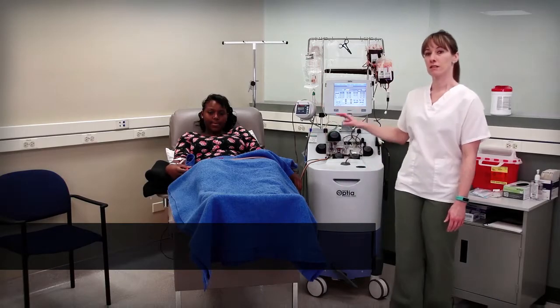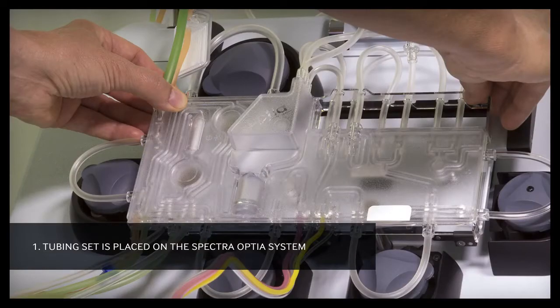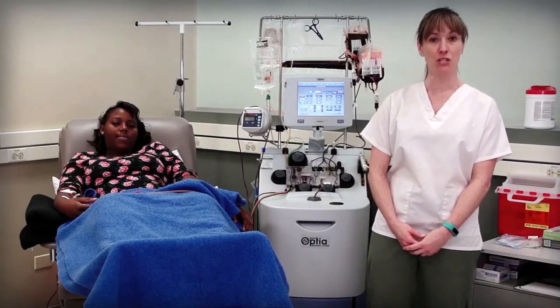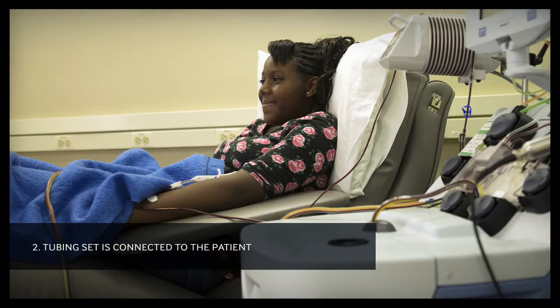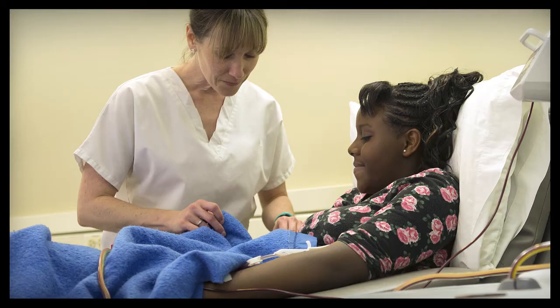First, the sterile tubing set, which holds the patient's blood during the procedure, is placed on the Spectra Optia system. Next, a clinician determines how the tubing set is connected to the patient. Options include needles placed in the patient's arm or arms. Depending on the length of treatment, more permanent options may be used.